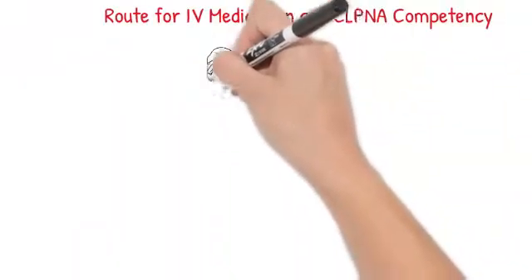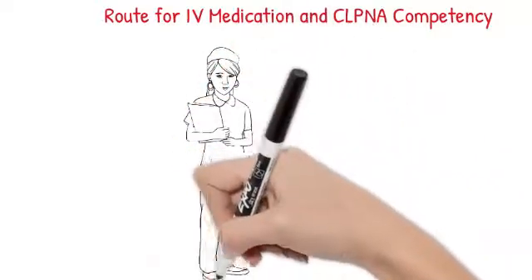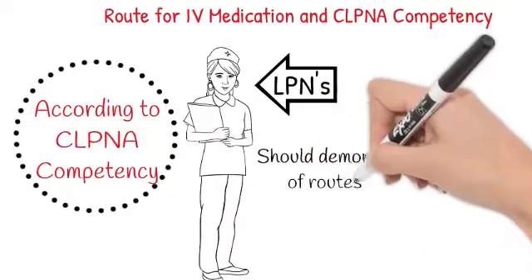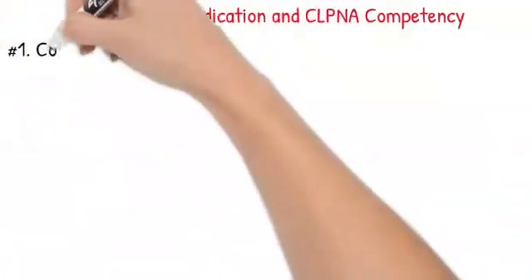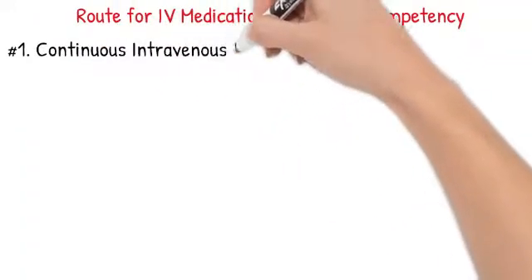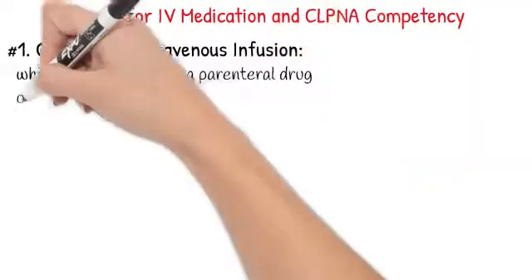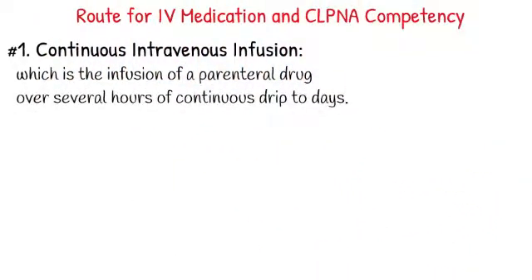Routes for IV medication and CLPNA competency. According to the CLPNA competency, LPNs should demonstrate knowledge of routes for medication administration by intravenous. The infusion can either be continuous intravenous infusion, which is the infusion of a parenteral drug over several hours of continuous drip to days.